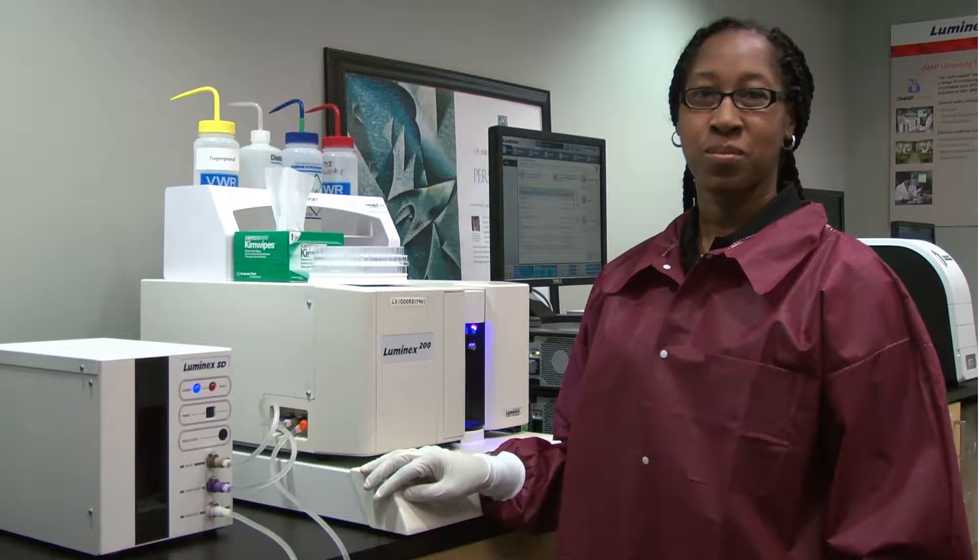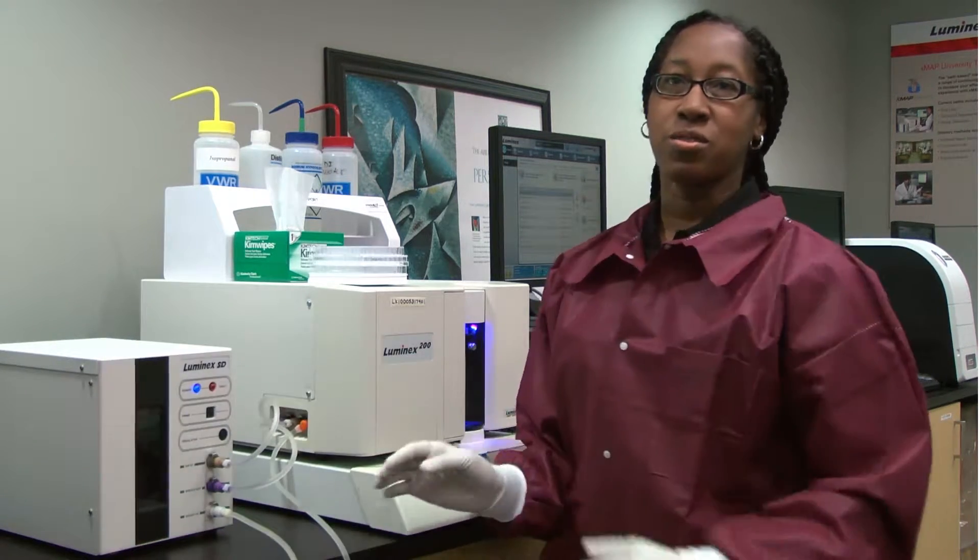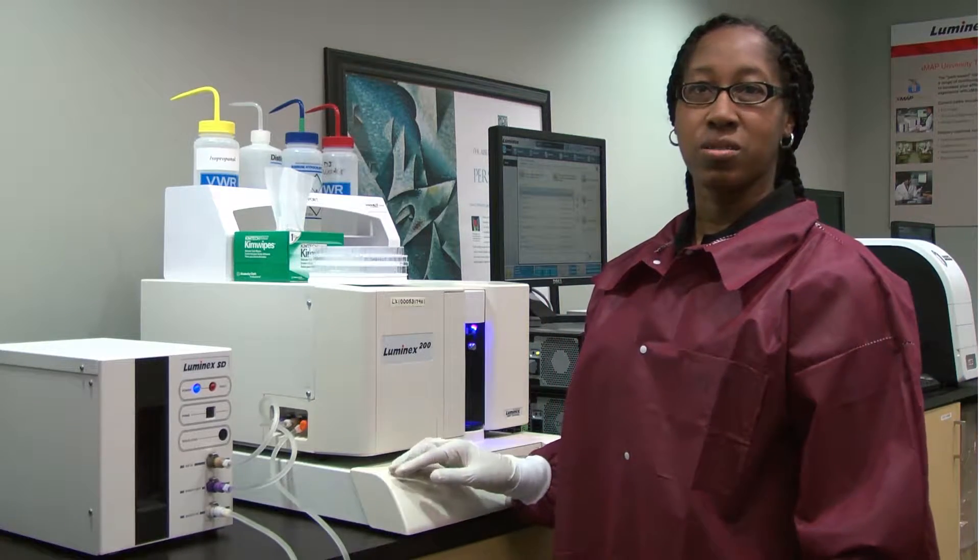Hi, my name is Stephanie Harris and I'm a Technical Application Specialist at Luminex Corporation. This is a quick tip on how to change the SDS unit to the sheath bottles on the Luminex 200 instrument.